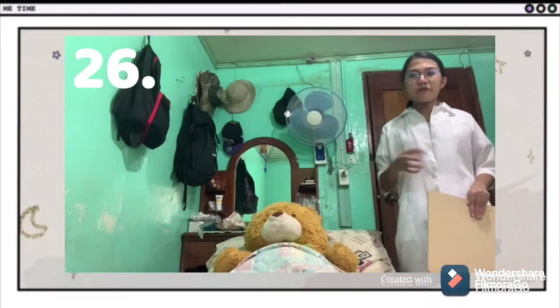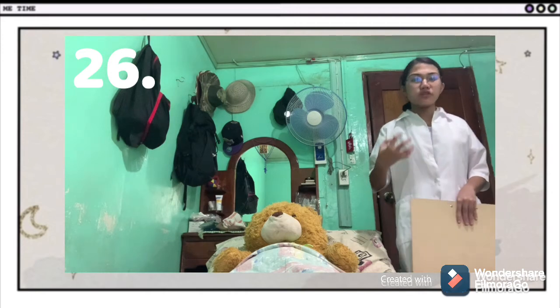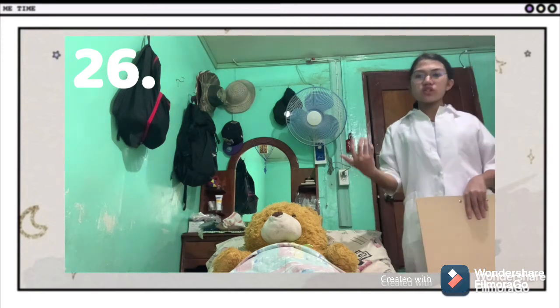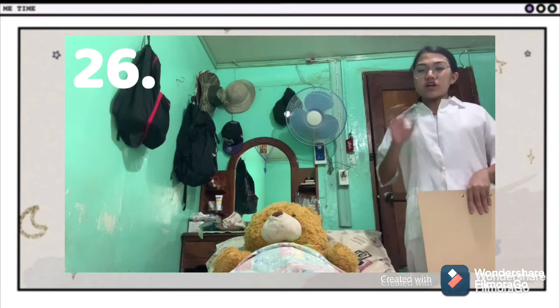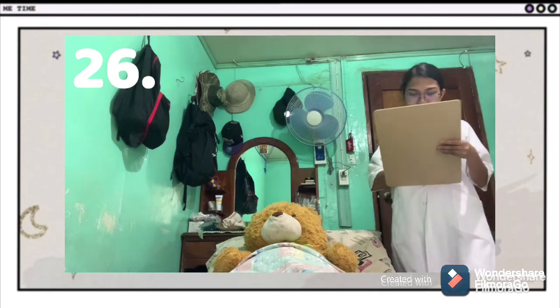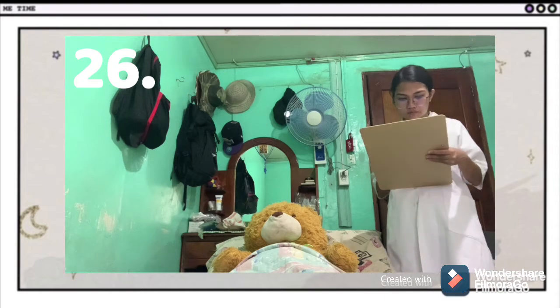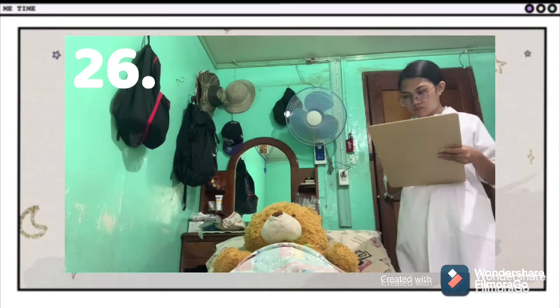Lastly, record the time of catheterization, the amount of urine removed, the description of the urine, the client's reaction to the procedure, and any other observations. A careful record is important. Reporting and recording of information about the procedure must be accurate and timely for continuity of care.